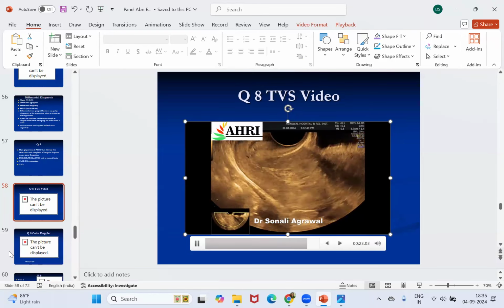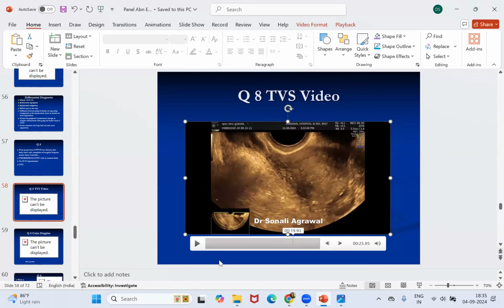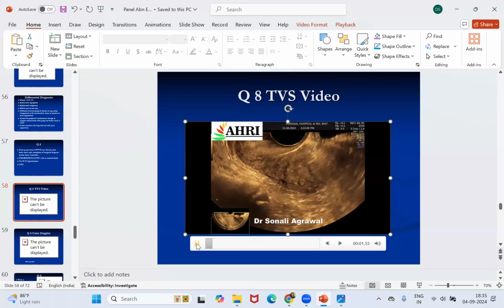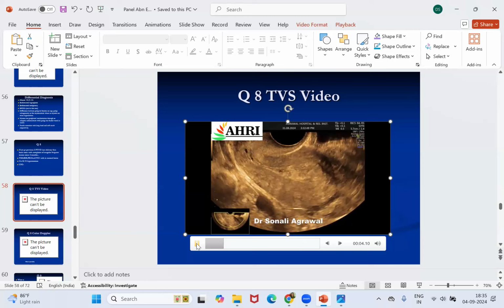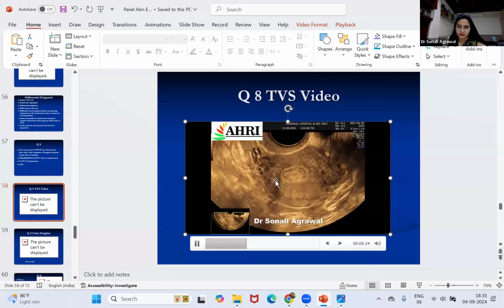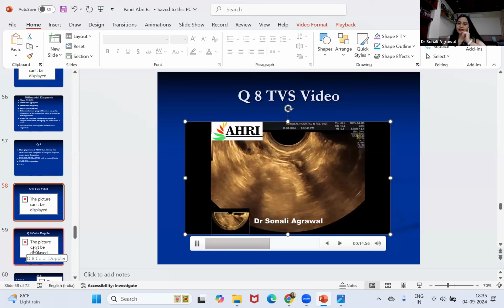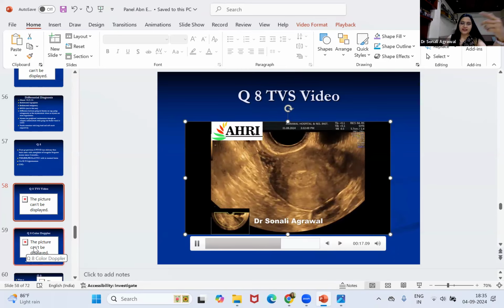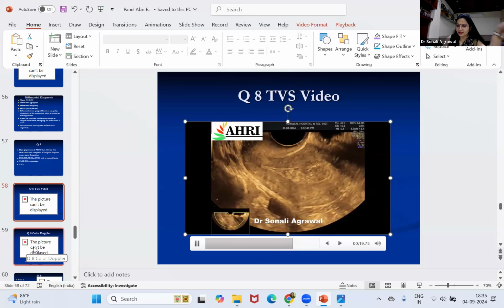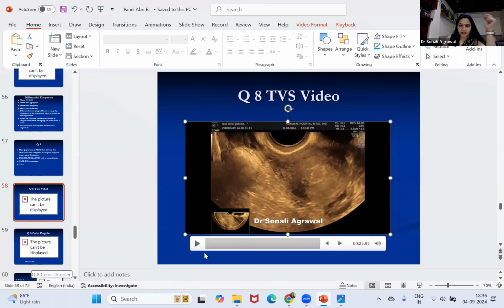The endometrium looks thickened and inhomogeneous, and there are a few cystic spaces that I can see, but the endometrio-myometrial junction is maintained in this. Right. So we can see here the mixed echogenic structure with the endometrial-myometrial junction well maintained in this patient. After seeing this ultrasound, I again asked her for any DNC or any history of pregnancy. Then she revealed that 2 months back she took some MTP pills and she was hiding all the history.